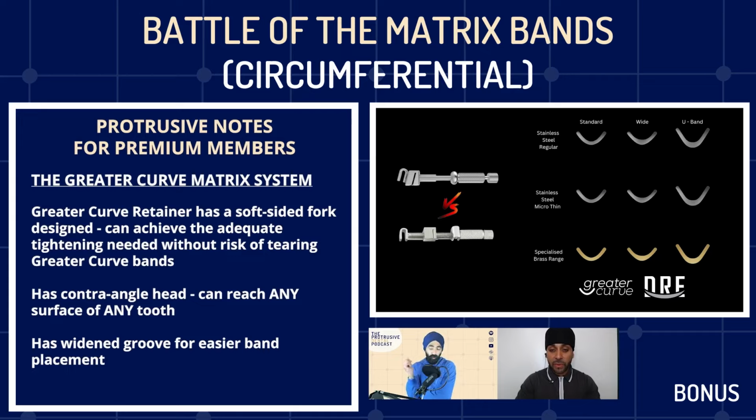I mean, the information I get on them, you're suggesting that, yeah, these bands can be used with your normal Tofflemire retainer, but if you wanted the best and you just wanted to get one and reap the benefits of it, then it would be the Greater Curve branded Tofflemire retainer. But the thing that, and I'm being very real with you, Sonny, is the thing that's almost putting me off now is I'm seeing a huge choice.